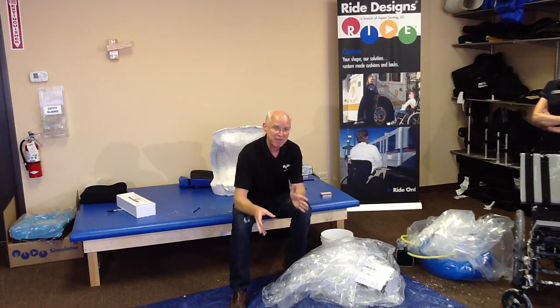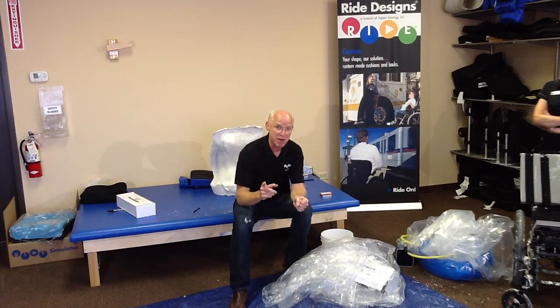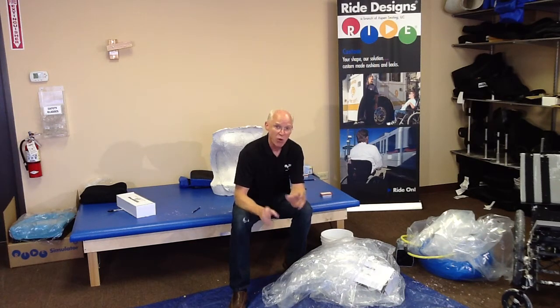At completion of the shape capture, I make sure I get my pictures, I mark my trim lines, I get my seat depth. Once I get those things taken care of, I can assist Jenn out of the simulation. Make sure my shape looks good, I remove the blue foam, and I cast my shape. Oh, I'm sorry, I'm going to reinforce my trim line marks, then cast down into the pan. Very important, we cast down into the pan for that cushion to back reference. Very important. Once I've casted, while that cast dries, I gather the team and I get all my paperwork done. I want to get all my paperwork complete.